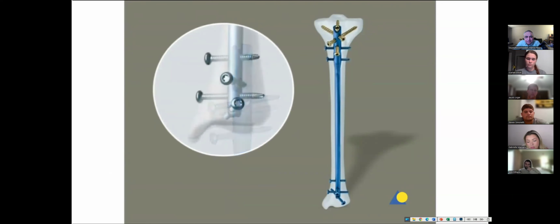There are 4 possibilities for distal locking. One oblique locking option is very distal. It allows two different interlocking directions for ideal bone purchase and prevents damage to soft tissues. There are two mediolateral options and one antero-posterior locking option for stable fixation of the distal fragment.